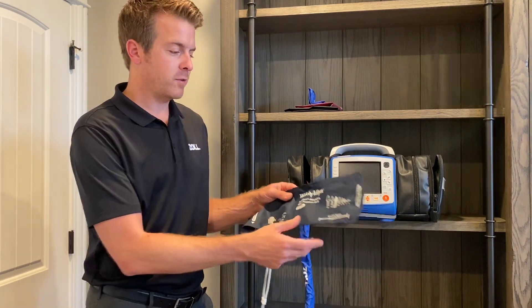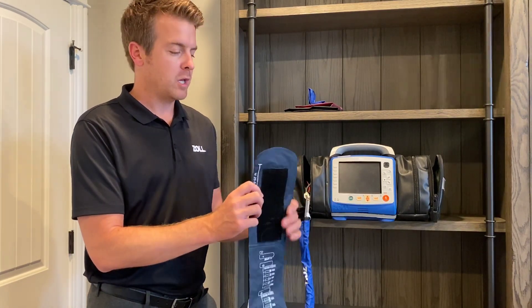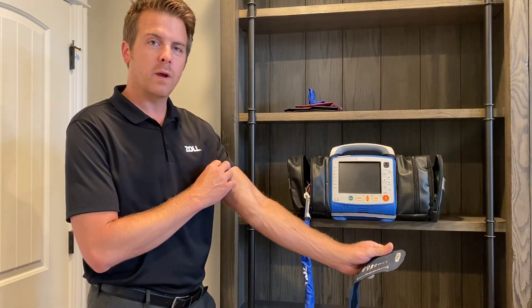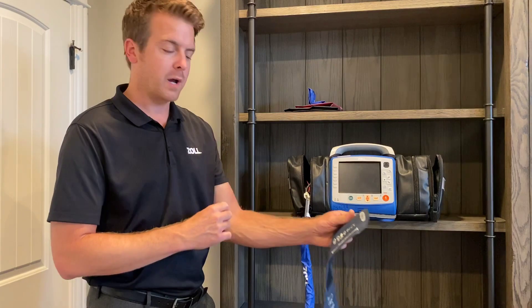It's really important to treat this cuff like an ECG electrode. You don't want anything between this material and the patient's skin, so make sure it's going right on their skin. That's the first thing you want to look out for.